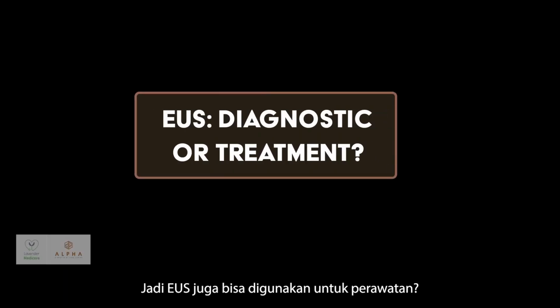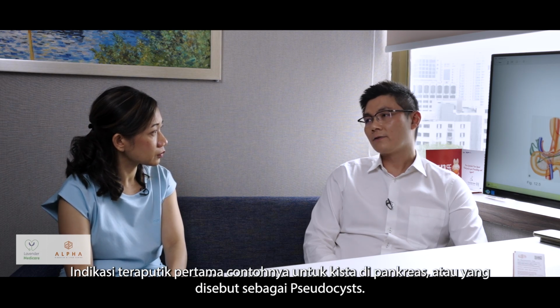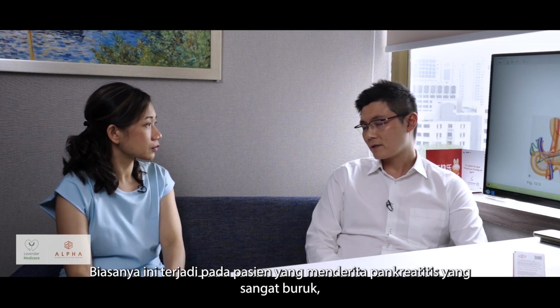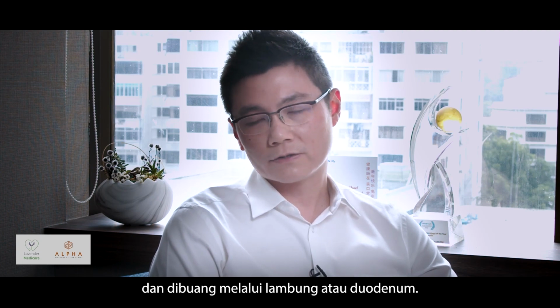I see. So it's also for treatment purpose? Mainly for diagnostic, but you're right. EUS is moving towards more therapeutic now. The first therapeutic indication would be for a cyst in the pancreas called a pseudocyst. These are usually in patients with very bad pancreatitis, and then EUS can be used to place a stent across the cyst and draining the cyst either into the stomach or the duodenum.